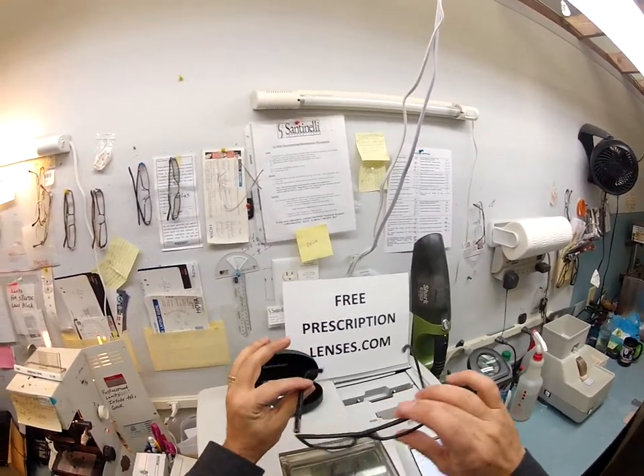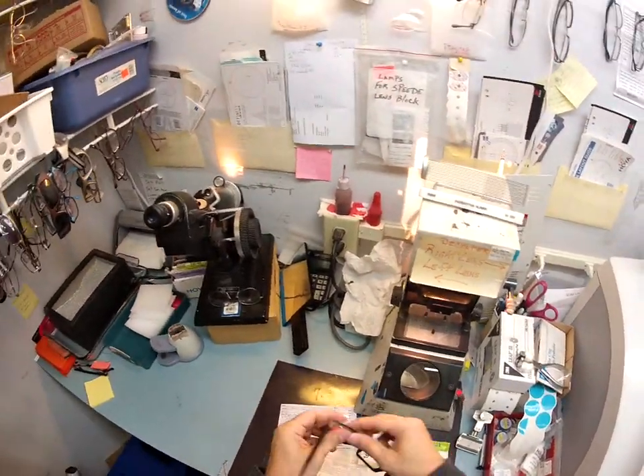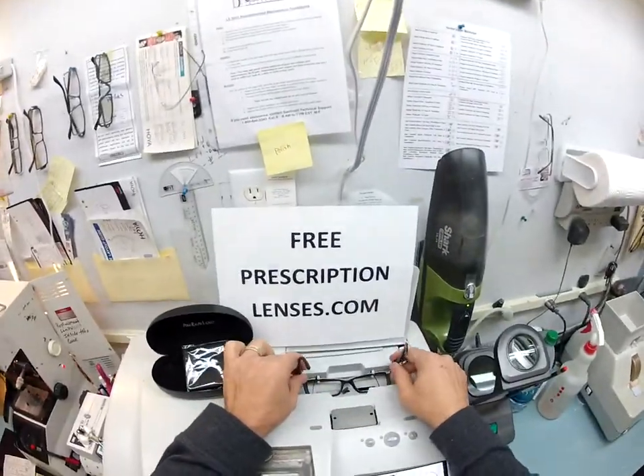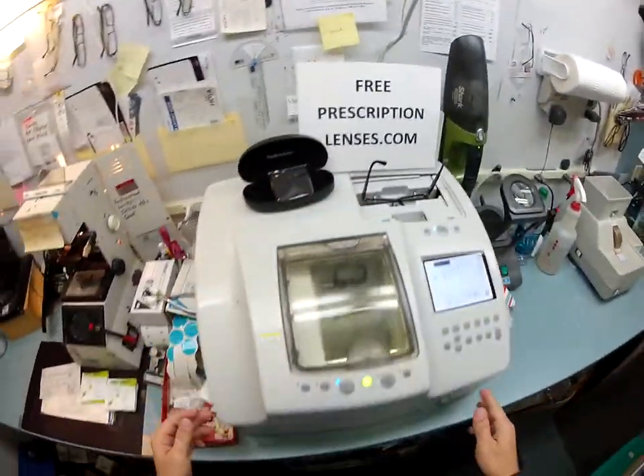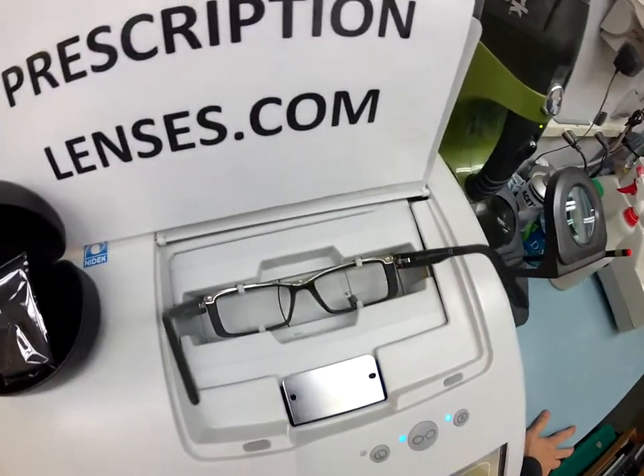which is the matte black with the platinum rider. I'm going to pop out the original demo lenses that come in here. I'll put your frame — your Italian frame — into my Italian Sentinelli LE1000 patternless edger and we're going to get started.